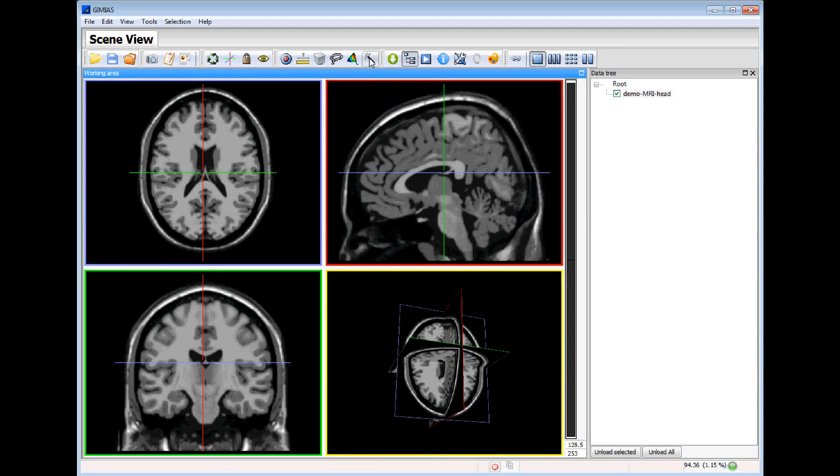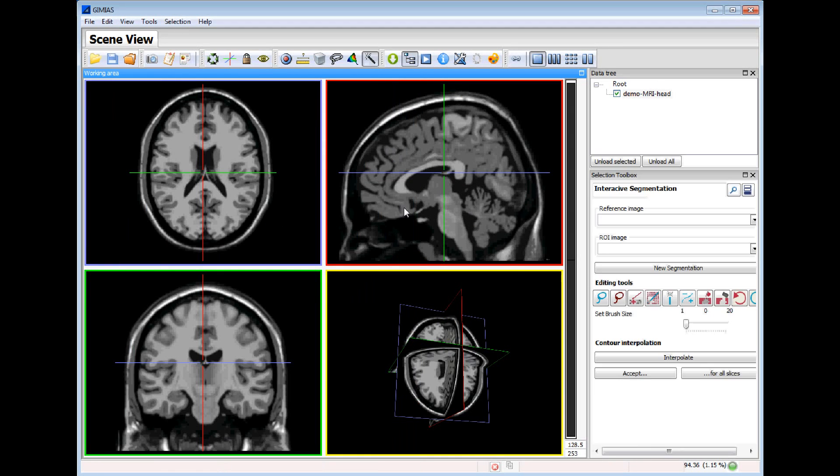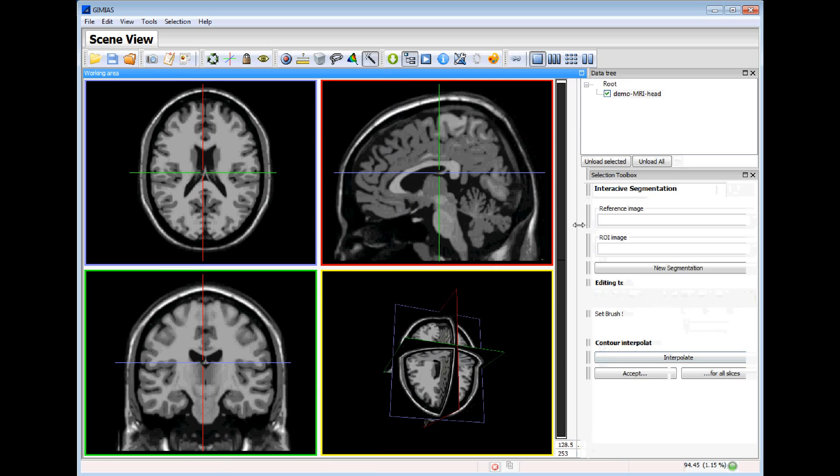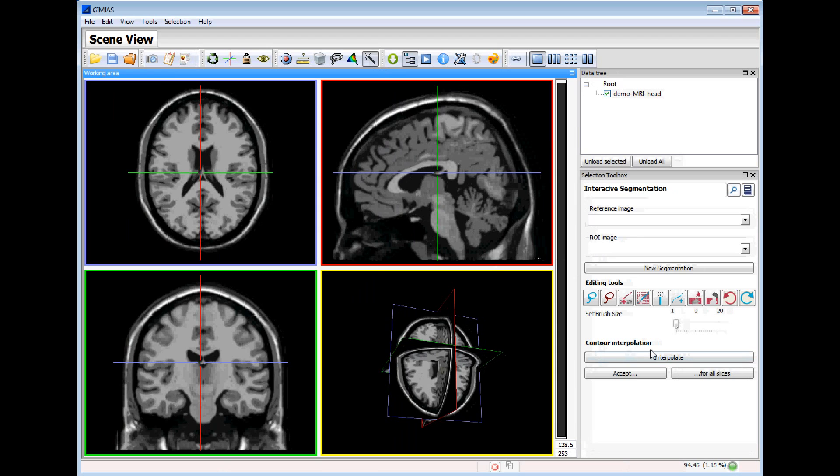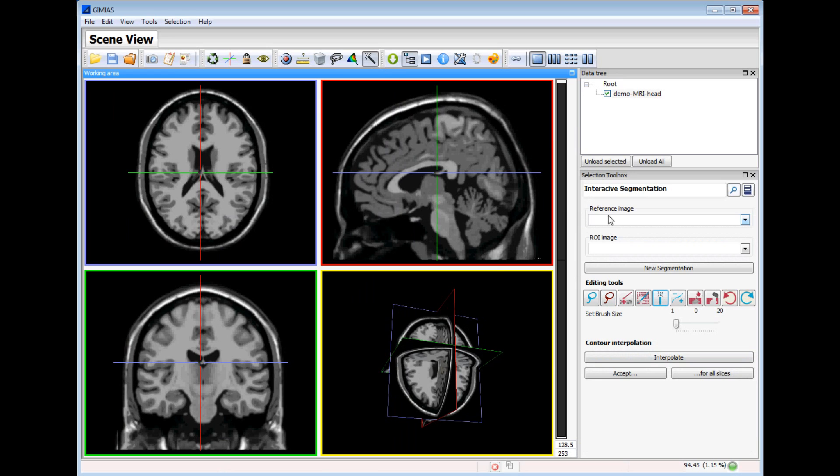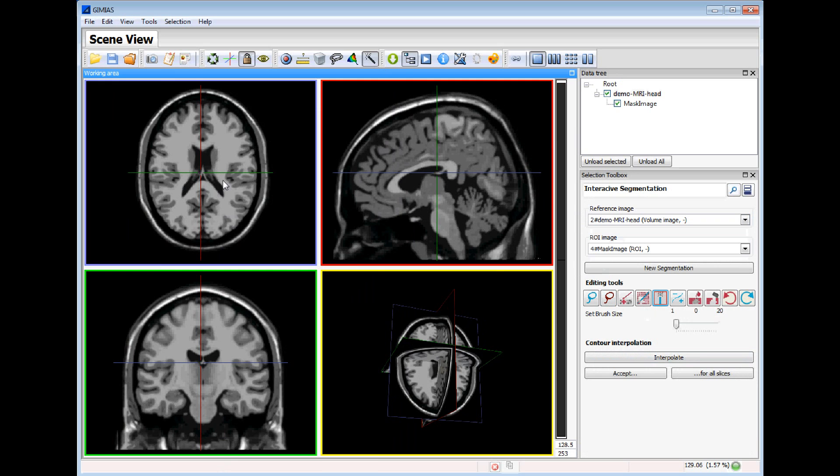Now we will proceed to the segmentation of the image. We open the interactive segmentation tool and we will start with the region growing tool. The first thing is to select the input image. Now we can select the region growing. So we start segmenting the image.